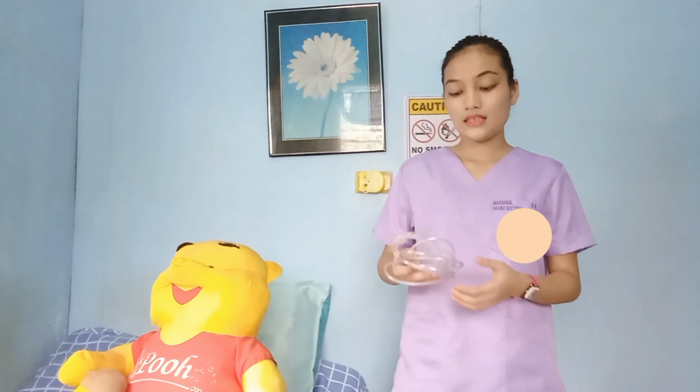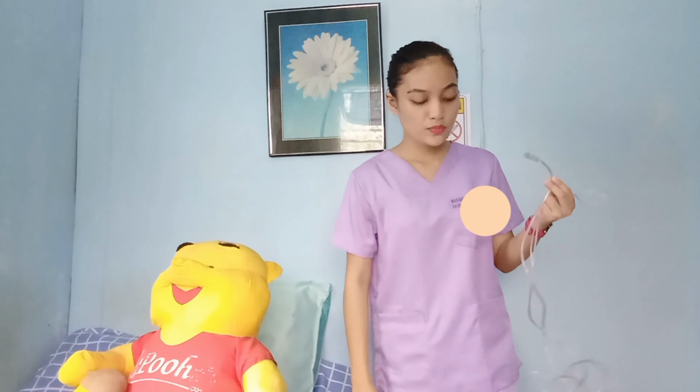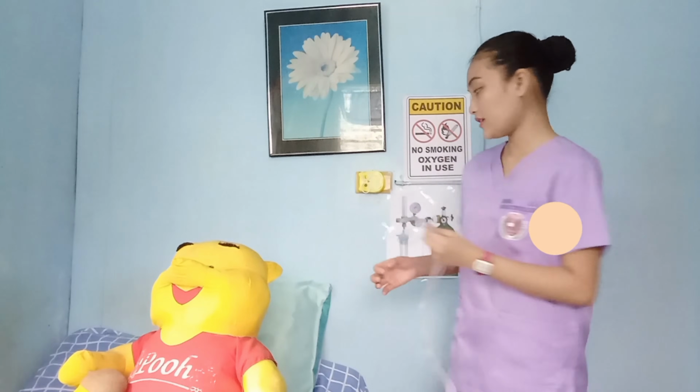Now, this nasal cannula delivers relatively low oxygen concentration at 24 to 45% with flow rates of 2 to 6 liters per minute. I am now going to connect this tubing into the humidifier.